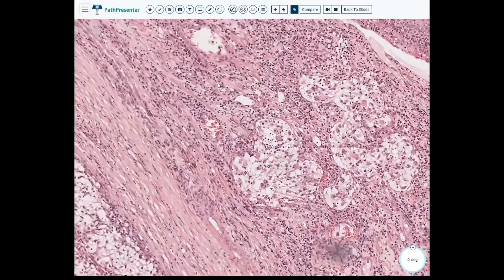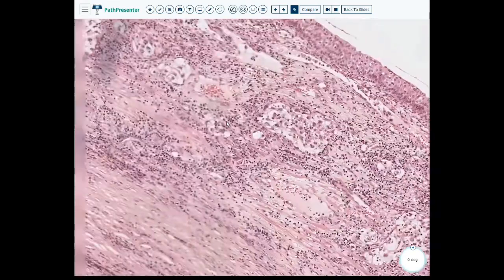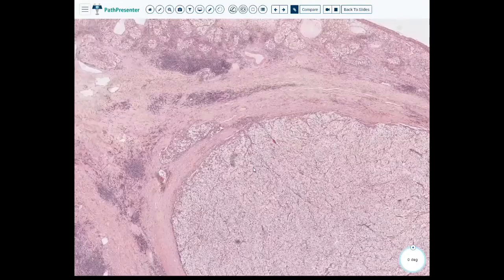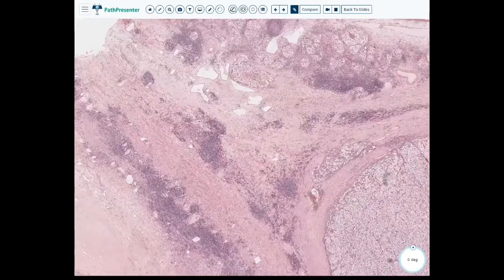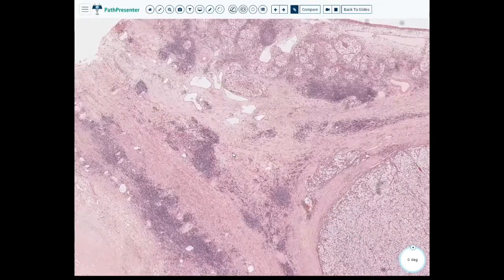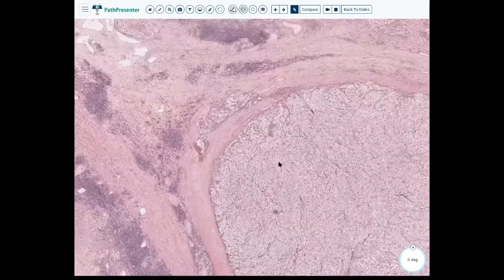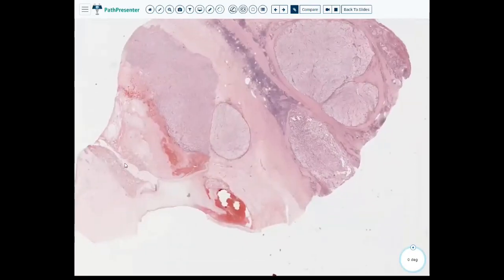Okay. So another clear cell renal cell carcinoma. You can see more of it up here. And again, whereas larger nodular areas like this would be apparent grossly, you might not even see stuff like this on your gross examination. Okay.